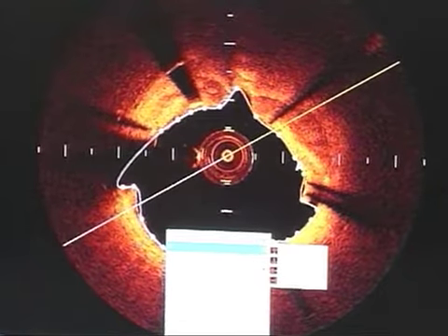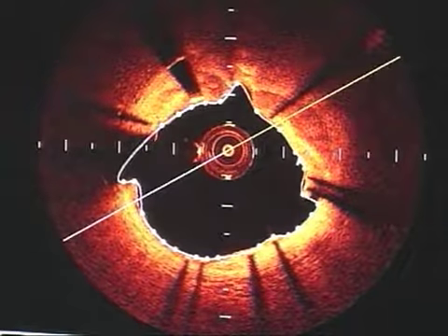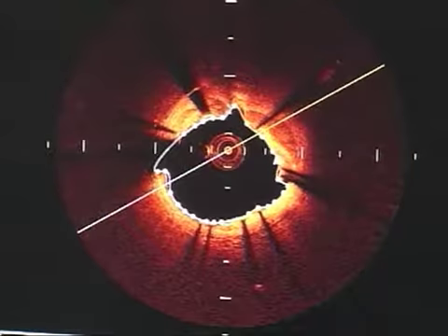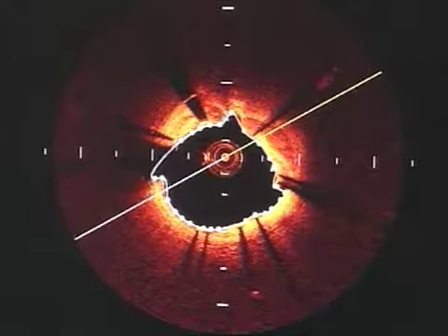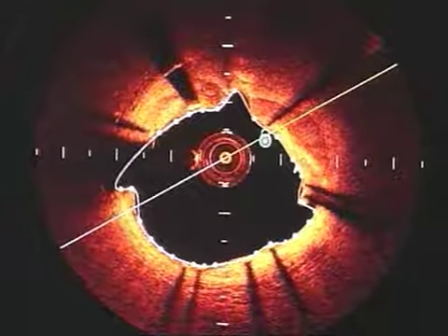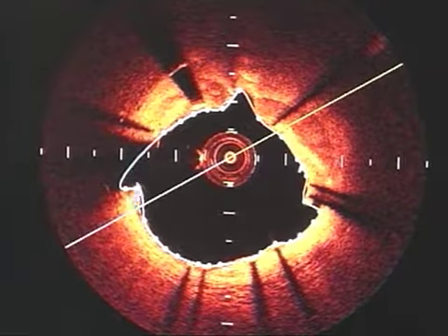No, but what I would still say, can we zoom in on one of the struts? Yeah, let's do that. Can we remove this? Go more proximally. Yeah, the thick one. Anu, when you inject 20 cc, can you dilute the contrast, or is there a recommendation not to? That is also an important consideration with the dye load. And therefore, many times the assist device may come handy for this purpose. Excellent. You give about 10 to 12, and forceful. Okay, let's go with that.